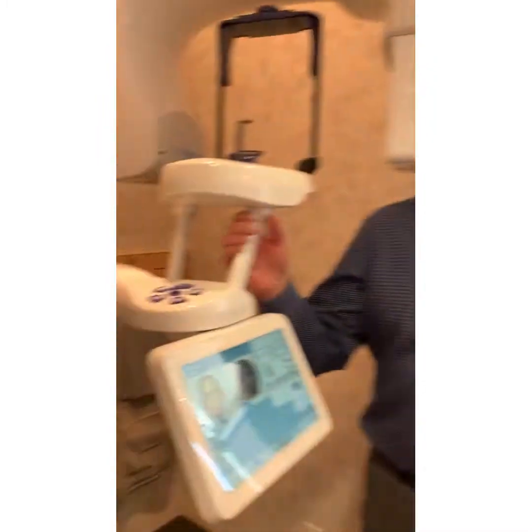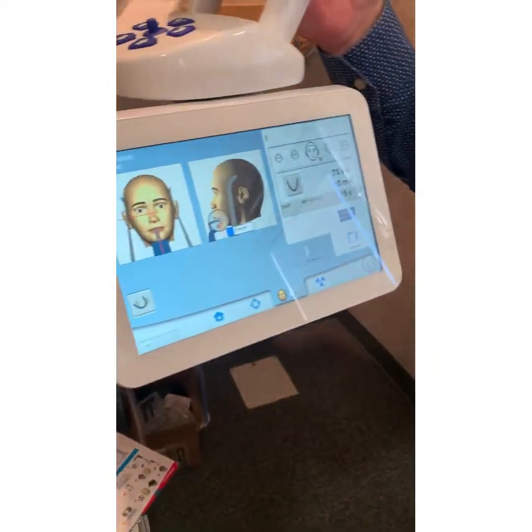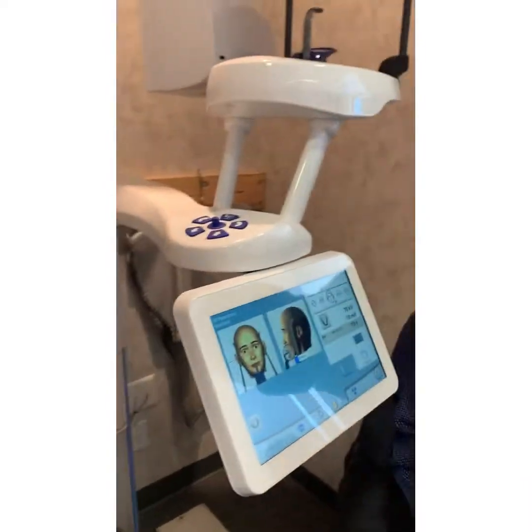I'll send you a link to this. I think really it's just going to be me doing it. I'm more of a hands-on learner. I'm listening to everything you're saying, but it's going to take me just doing it and figuring it out. Push the buttons.